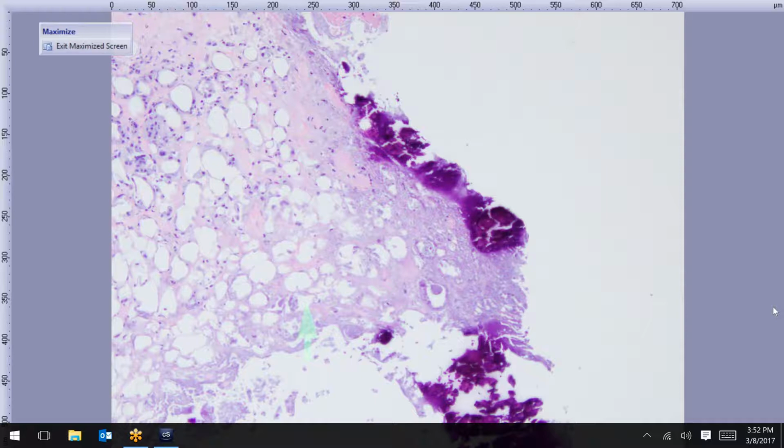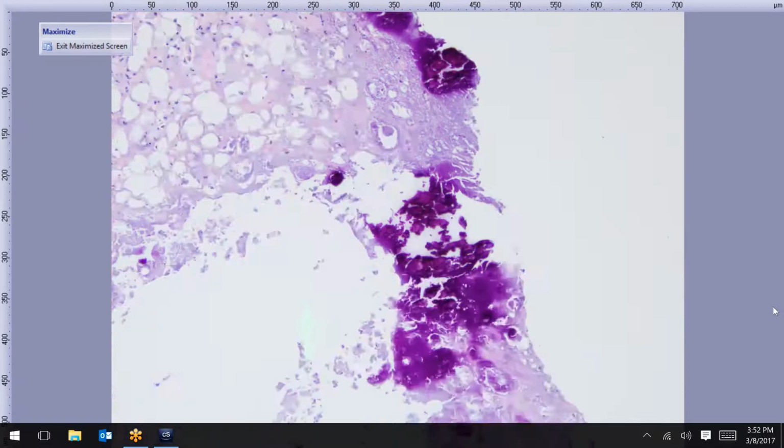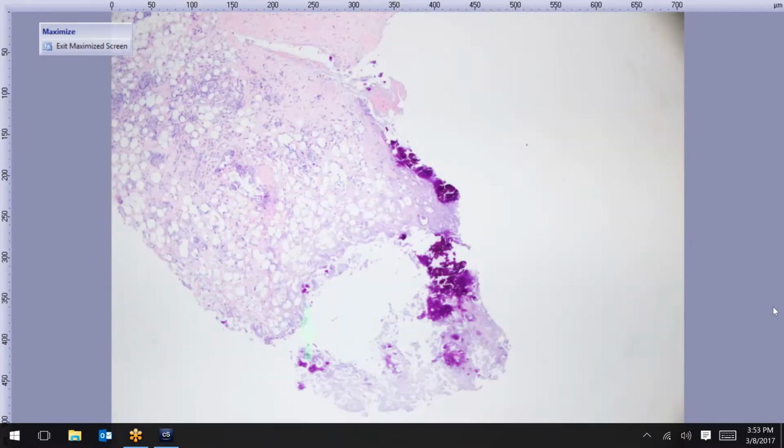So this patient, when I saw this slide, I inquired with the doc, and has no known history of any pancreatic issues, but had some recent GI complaints: bowel changes, nausea, vomiting, diarrhea. So I think some lab work is pending. I think they've got the amylase and lipase, and they might be getting a CT, so they're trying to find out more. So I think this was a neat case. This is where we came in to offer the first clue that maybe there's a pancreatic issue with this patient.